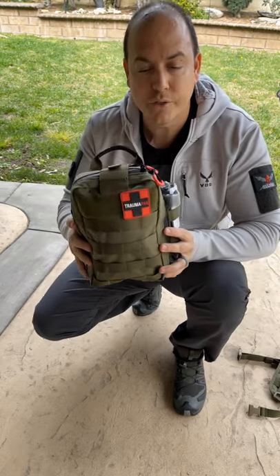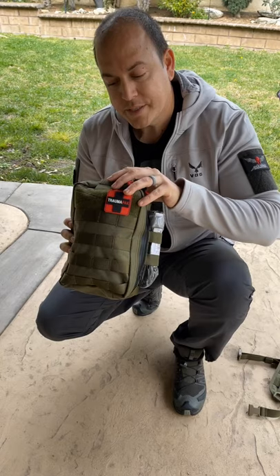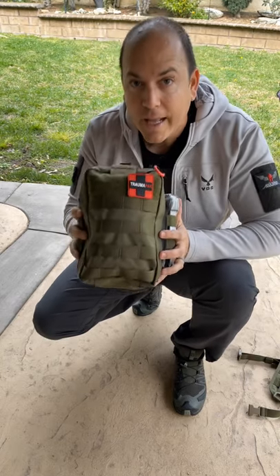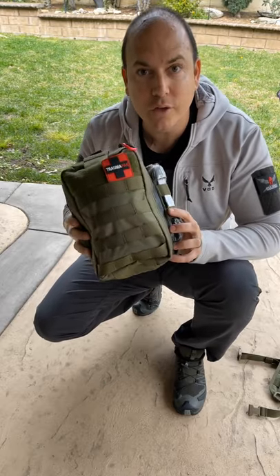You have two options for a tourniquet. Looking inside, I want you to see that this is geared to both treat the canine handler and the canine itself. So let's take a closer look.